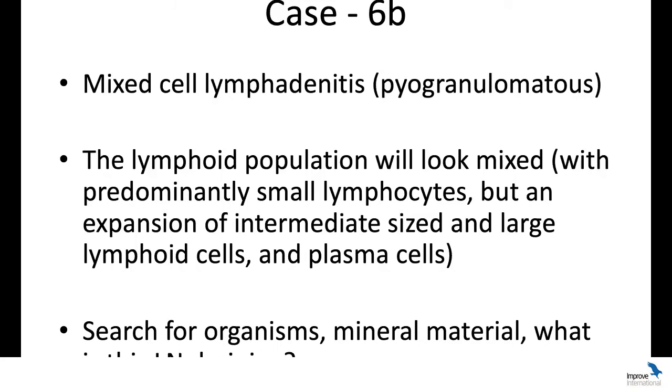When you have that mixed cell lymphadenitis, make sure that you're searching for organisms, mineral material, and pigment, and then think, what is this lymph node draining? What might be present here?